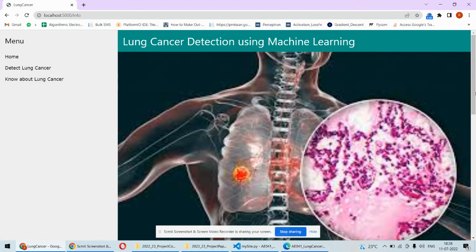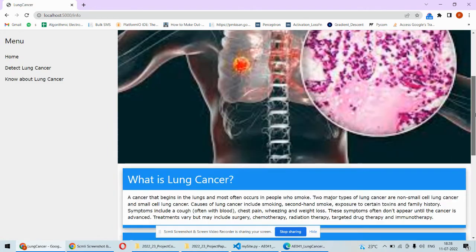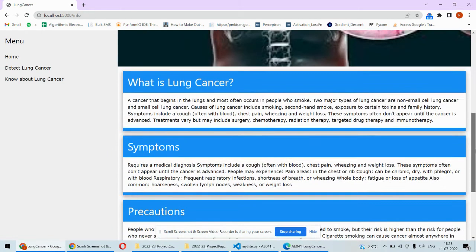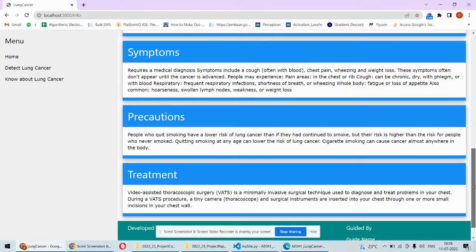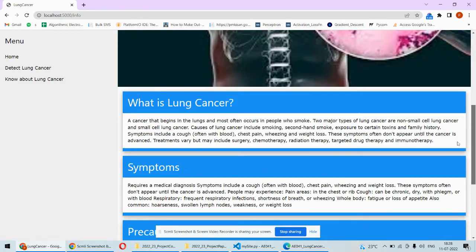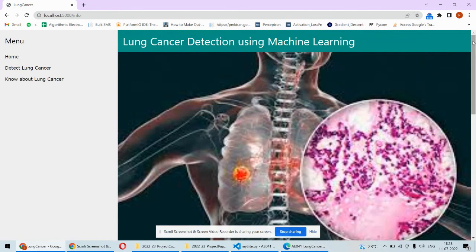And of course we are having one additional page about the lung cancer, its symptoms, precautions, and here also you can add your own information as well as it is a static page. In fact we can add multiple such pages as well.